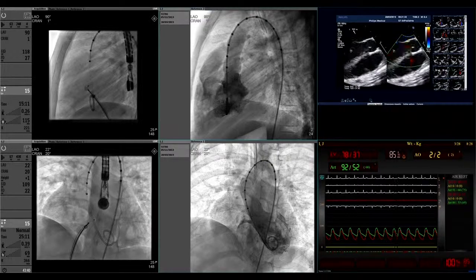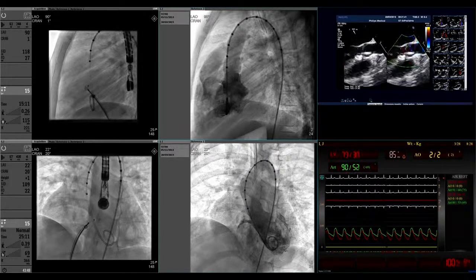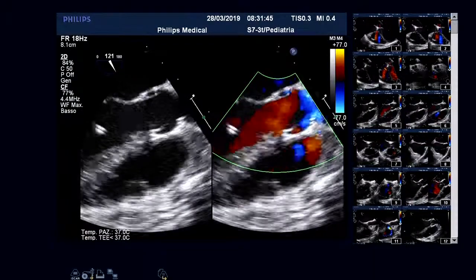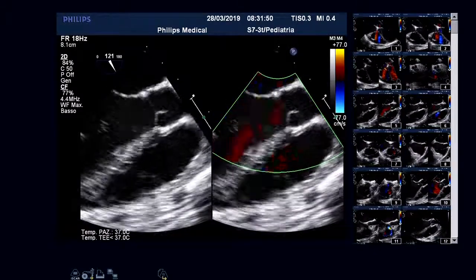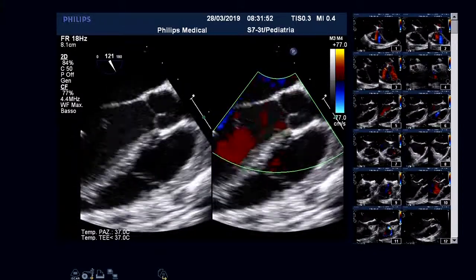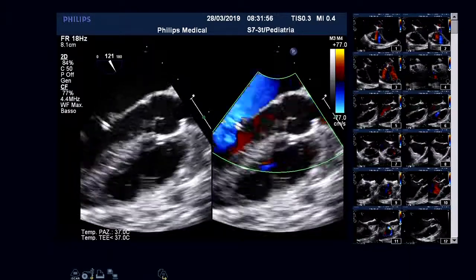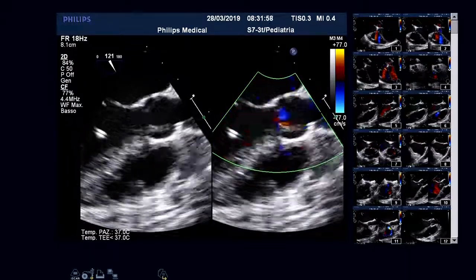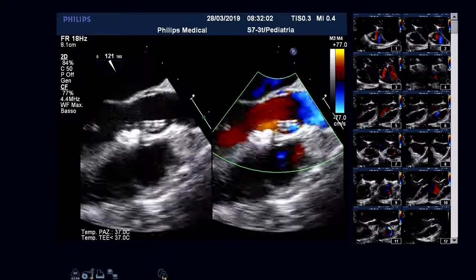Yes? I think on your 3 cases embolized, the devices move to the aorta, and to the left side. I think the device does not go to the right side. You think it goes to the right side, but it's not really. You see at the first attempt, the device is a little bit in the left side, and you see the device still moving. And I should pull back the device to the right side. So you mean you feel some kind of resistance?